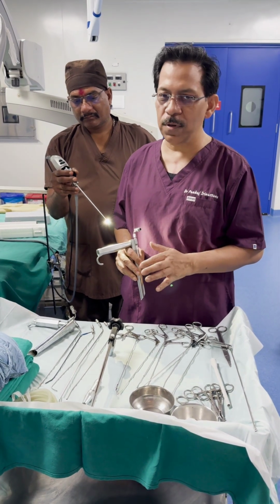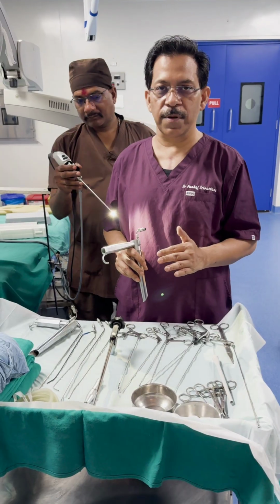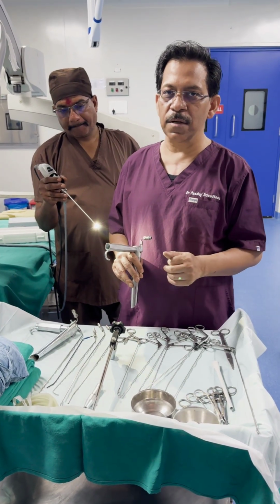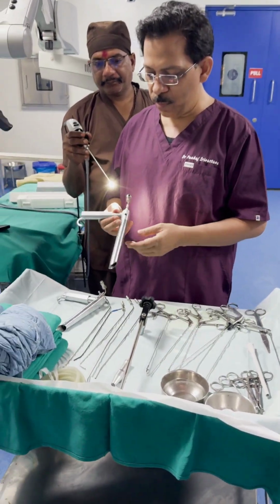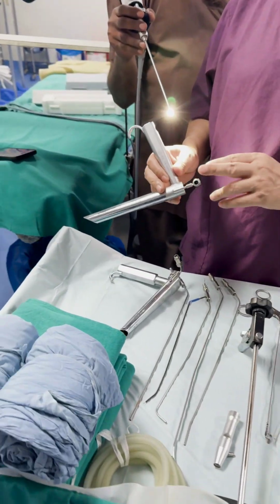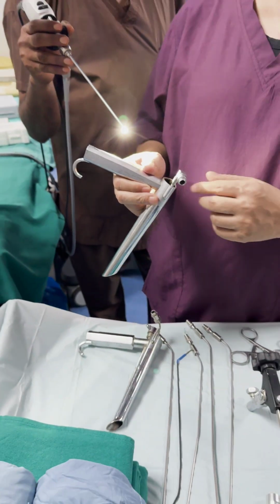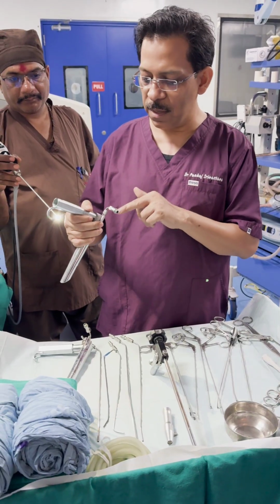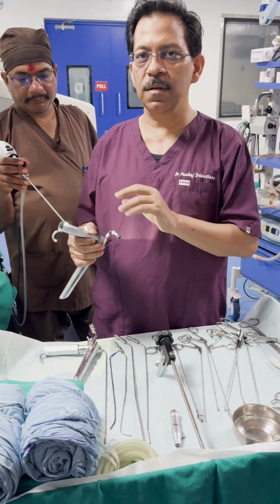So before general anesthesia, it is not easy to define that this patient will have a problem in seeing or operating the anterior commissure. So what are the options? Now we have two types of laryngoscope. Everyone has this adult type. This is a straight one, and when there is a lesion that we can see in the larynx directly, straight lesion is visible, then only lasers can be used.